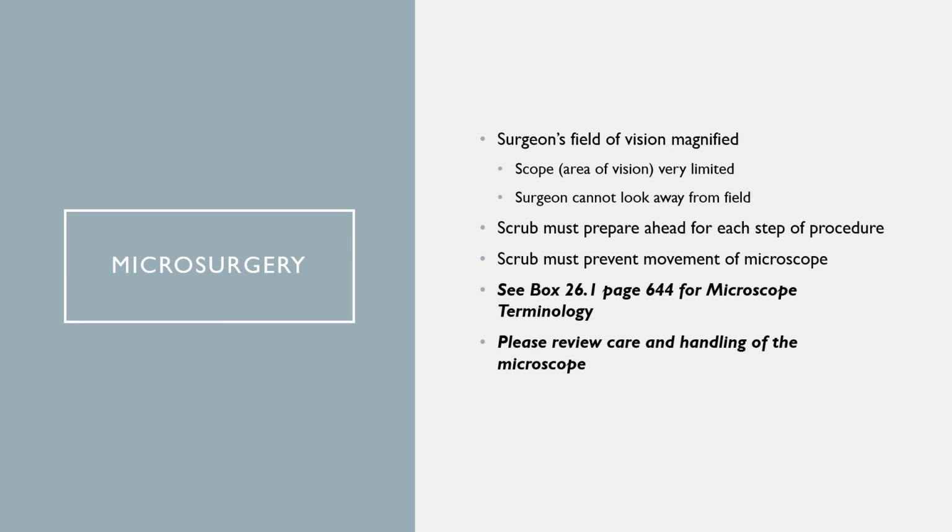A lot of times you may be working on the scope with them. That's where we need to know exactly where our instrumentation is at. And we need to make sure that we're preventing any movement of the microscope. It may sound silly, but limit your caffeine intake before scrubbing for an ophthalmic procedure, to make sure that our hands are steady.